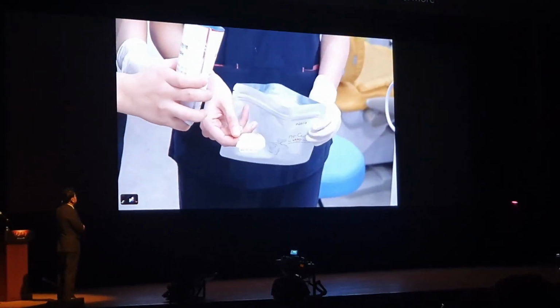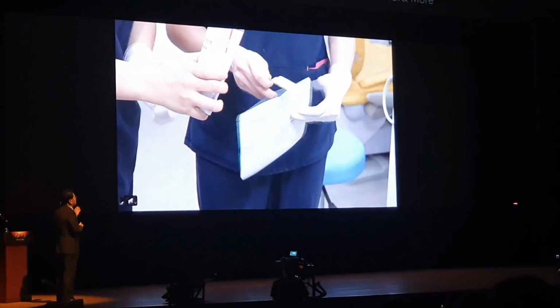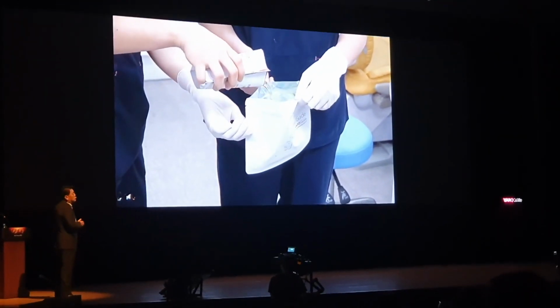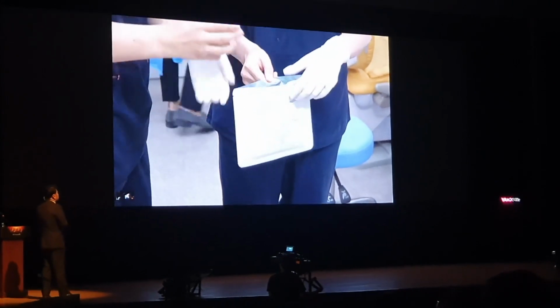The index pre-guide now goes to the package filled with antiseptic solution so that we can control cross-contamination by storing the guide inside the solution.